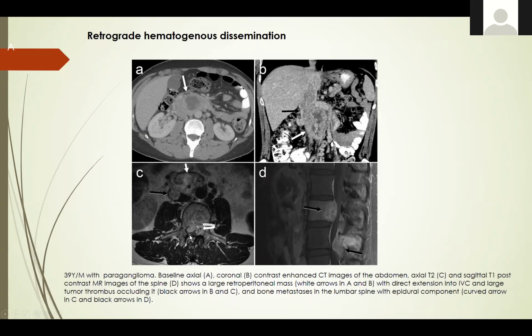And then there is tumor in the spine. There's spinal metastasis with epidural component. So this is all spread by retrograde dissemination.